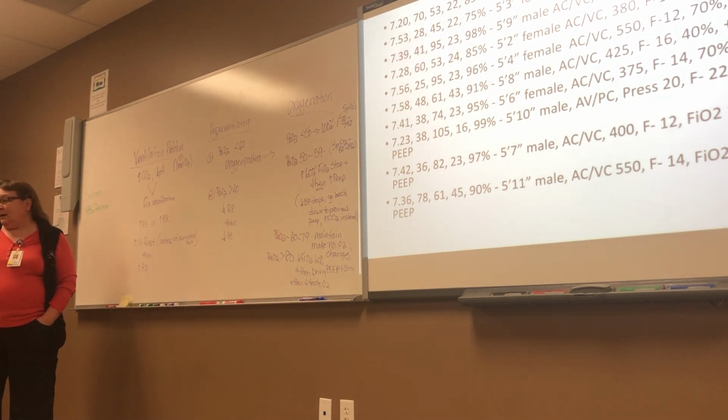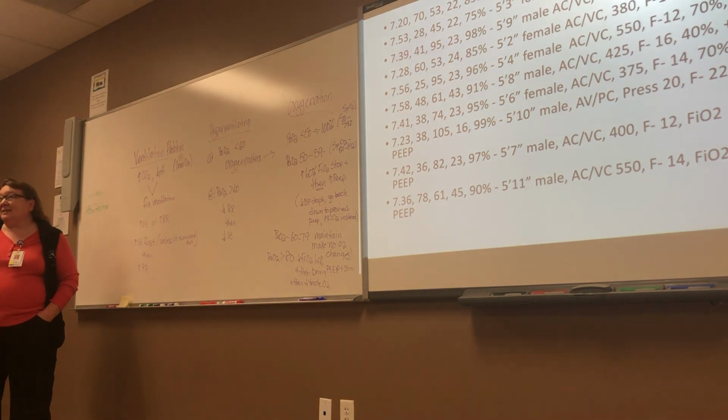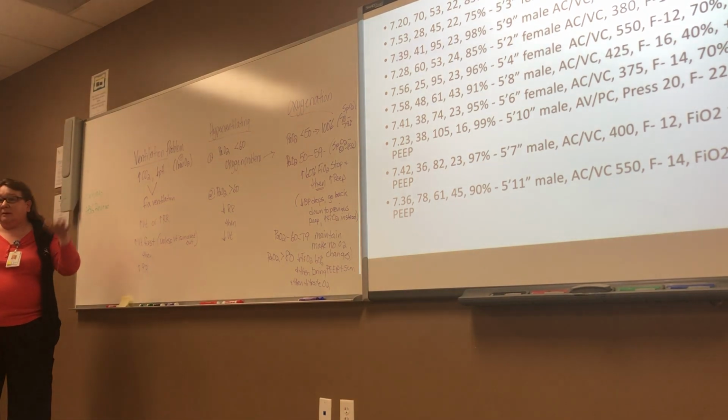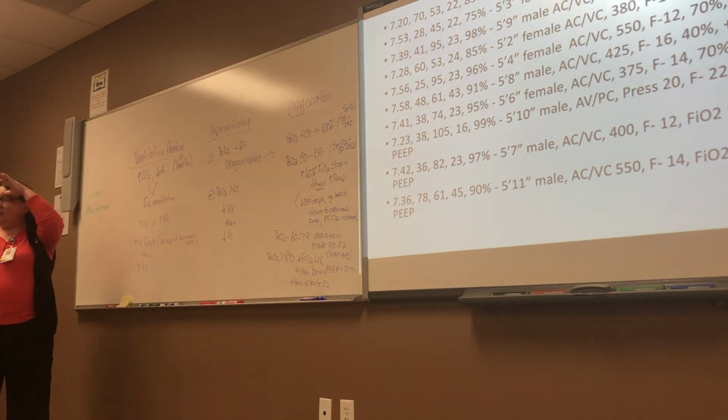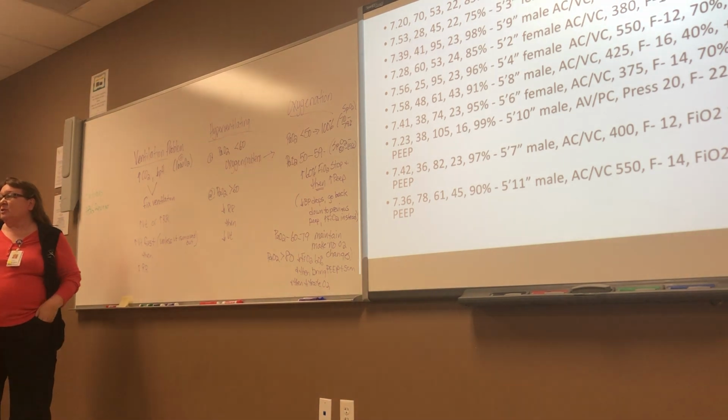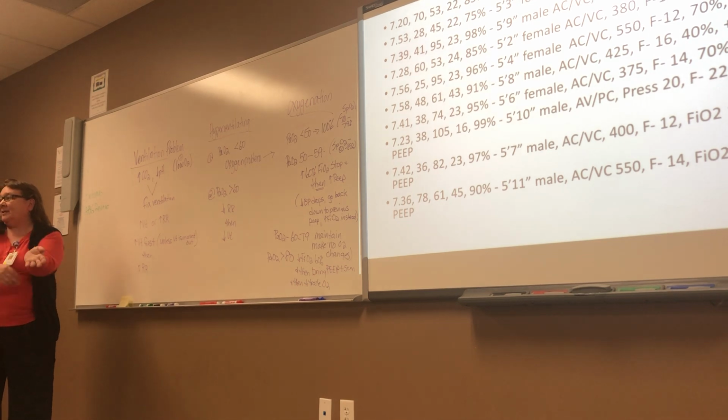If your patient is on AC and has a hyperventilating problem like that, I might switch them to SIMV to see if they're just getting too many mandatory breaths. But there's probably another thing going on, either a neurologic problem or a fever, or some kind of high metabolic demand, which means you're not meeting another need, or the patient wouldn't need to hyperventilate.